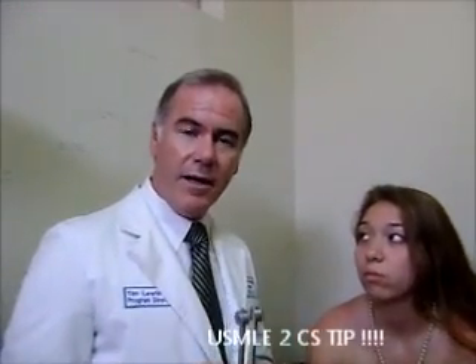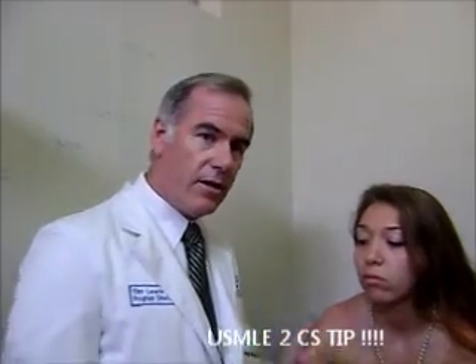This is a USMLE tip. Sometimes, as you can see, this takes a long time. When I put it here, it takes her a while before she can't hear it. You can use your finger like this on the tuning fork — don't touch here, but move your finger up and down on the side, and it'll slow down the vibrations faster.